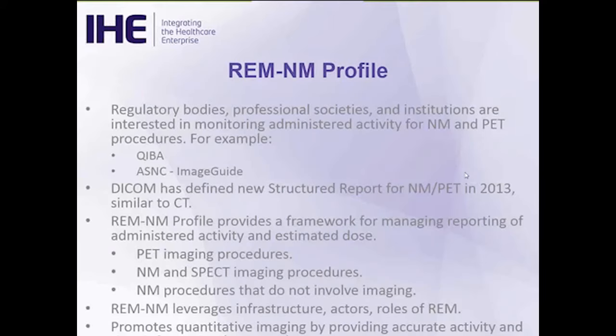So looking at the REM-NM profile, there's a couple reasons for doing this. One is regulatory bodies that are already regulating X-ray dose are also looking at other dose that's imparted to the patient. We also have professional societies that for a number of reasons are looking at procedures in the institutions, looking at the types of dosing being done, making recommendations on how to do that in order to improve not only dose to the patients, but also improving image quality.